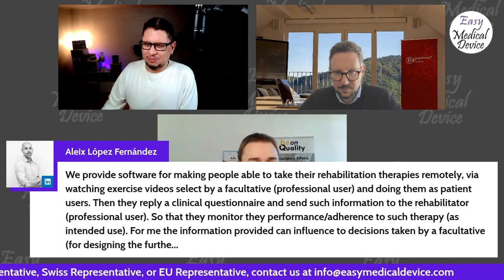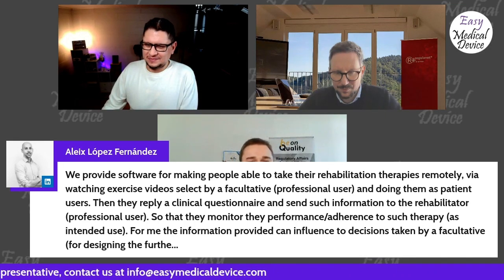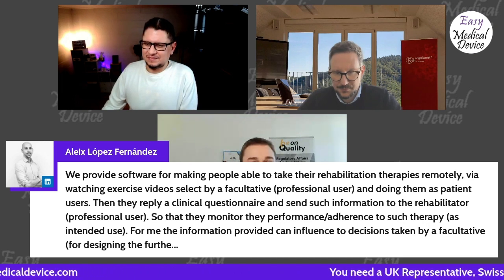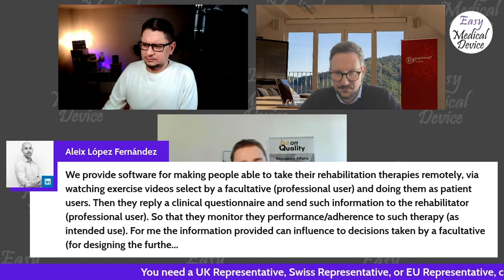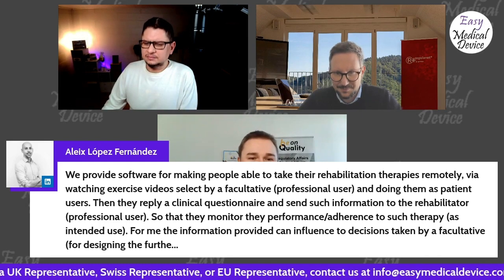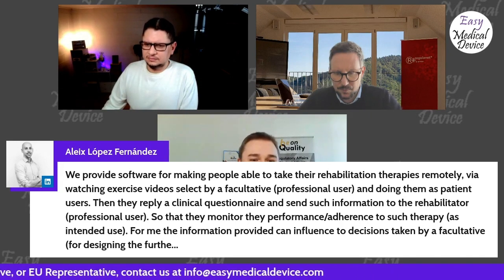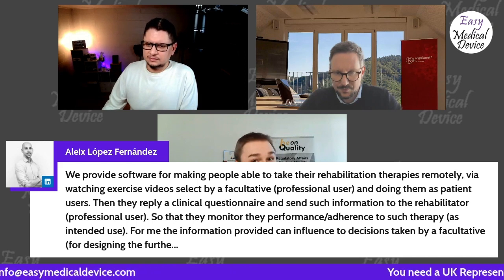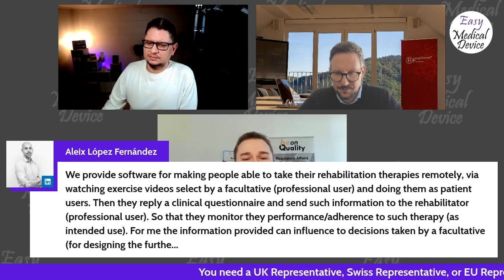And then comes the frustrating part: now I sign in to a questionnaire and give my information to my physician about how I utilized this kind of therapy, digitalized that therapy, and gave feedback. That feedback will be taken into account by the physician again. So if that is nothing automated, then it is just a selection of videos by a physician of what you shall watch. No medical device. Please correct me if I'm wrong, Oliver, but that's my opinion.